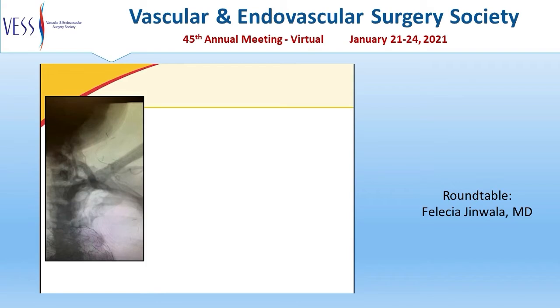The decision was made to take the patient to the operating room to better characterize her lesion. We accessed the left radial artery, and a 5 French radial sheath was advanced. A glide wire was advanced into the aortic arch, followed by an angled glide catheter, through which multiple fluoroscopic images were obtained in various obliquities.